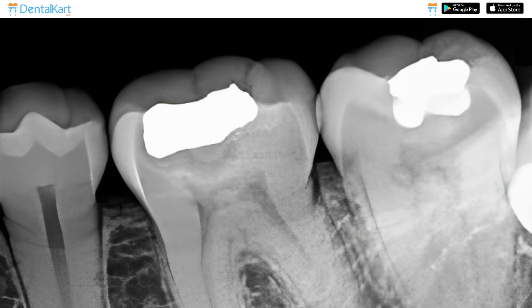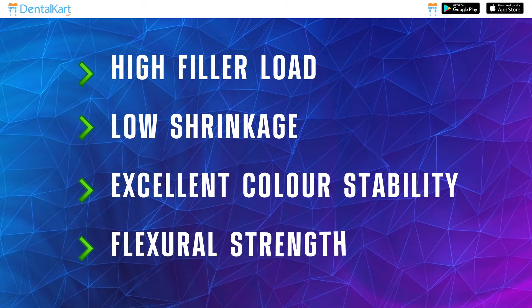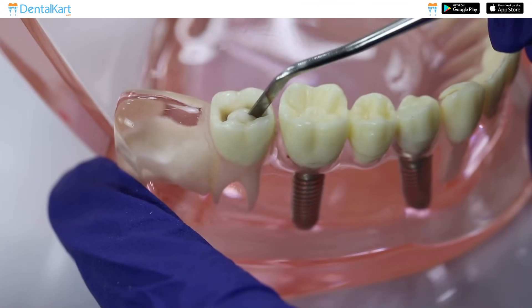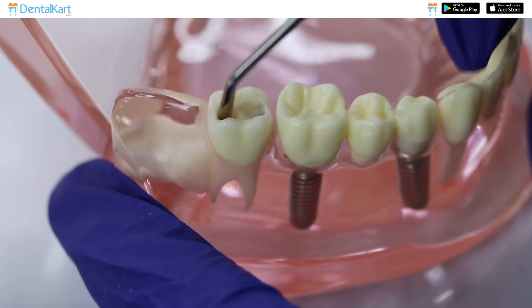It has high radiopacity, high filler load, low shrinkage, excellent colour stability, and flexural strength. It is easy to control during placement as it has packable consistency and also adapts well to the cavity walls.